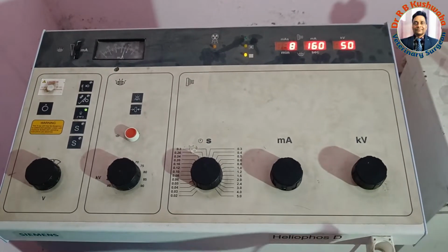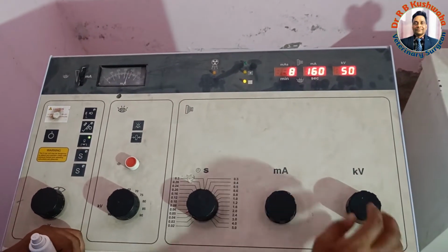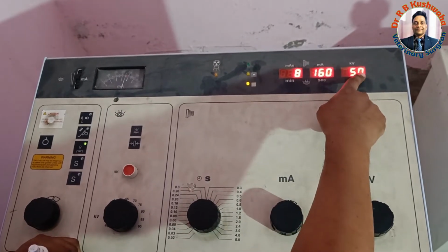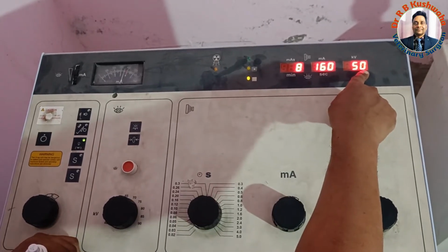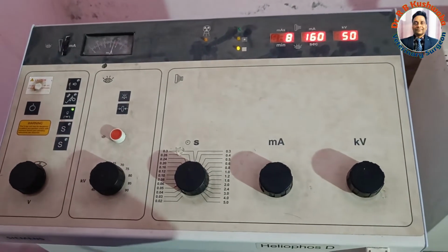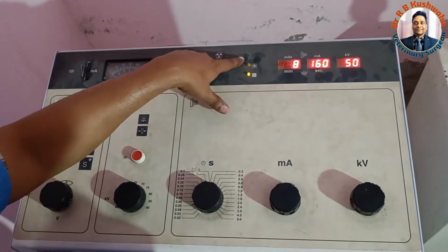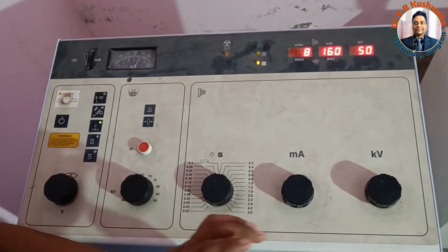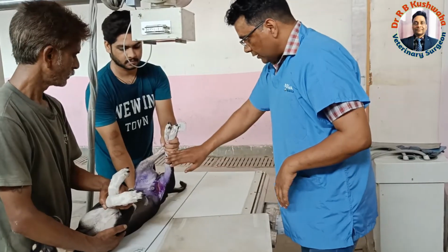So this is the 600 mA X-ray machine. We have already set the different exposure factors. You could see here, this is the mAs, this is the mA milliampere, and this is the kilovoltage peak. We have kept the mAs at 8, kilovoltage peak 50, and milliampere 160. The moment I expose, there will be deflection of the needle, and this green light will glow. Now the X-ray exposure has been done. We have just taken the mediolateral view.